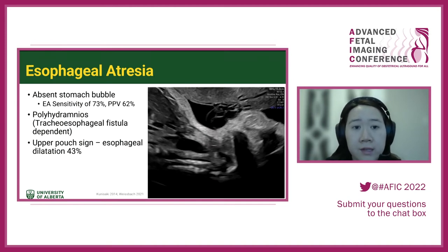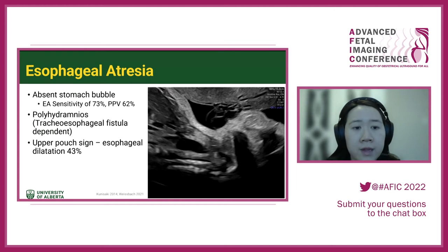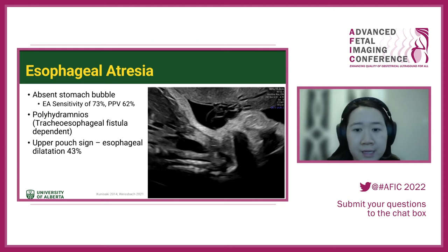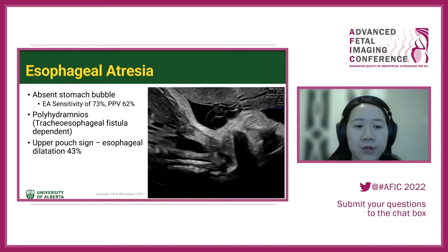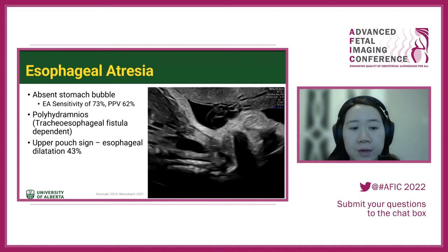One entity to think about is esophageal atresia. When we see an absent stomach bubble, the positive predictive value for esophageal atresia is unfortunately only about 62% — detection is not great. Sometimes there can be polyhydramnios depending on the situation with a tracheoesophageal fistula. Another important sign to look for, not in the fetal abdomen but in the fetal neck or upper chest, is the upper pouch sign — a dilated blind esophageal pouch, seen in up to about 43% of cases.